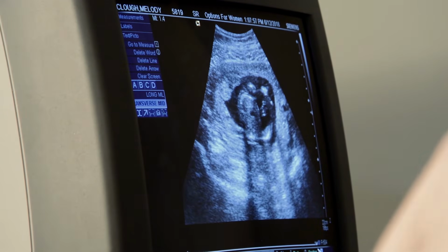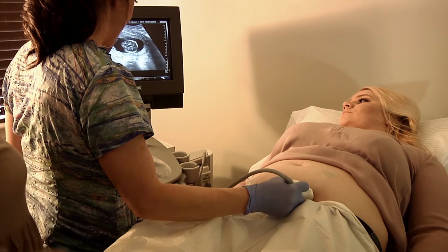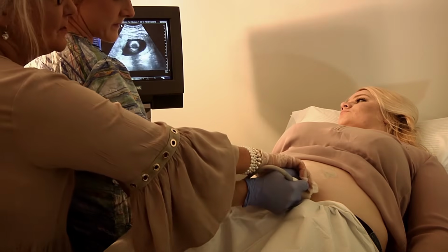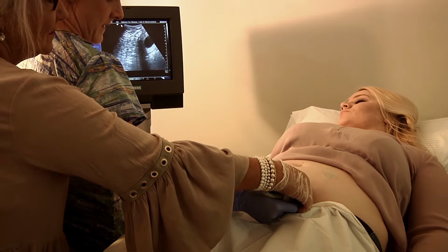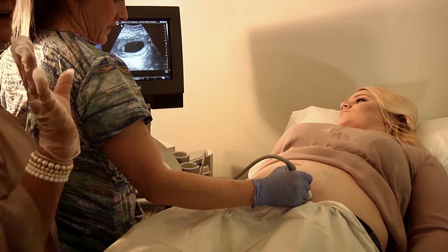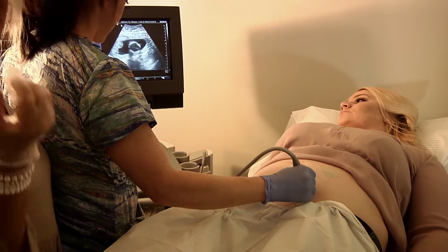Okay, we're done with mom. Now we've got to find the baby's lie. So I'm on the baby. Put any part of baby on the screen, but make sure when you're turning your transducer, you're turning the correct way. Here's your transverse. You always go either clockwise or counterclockwise. Anything past 1 o'clock or 8 o'clock is what we call no zone. You cannot pivot your transducer past that, otherwise you're going to be scanning backwards.